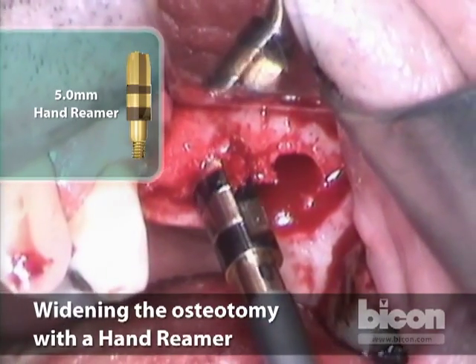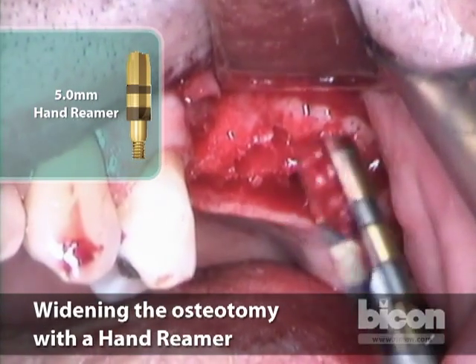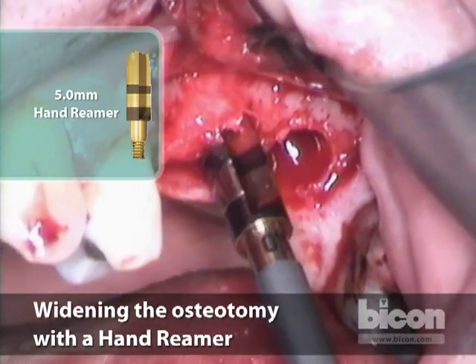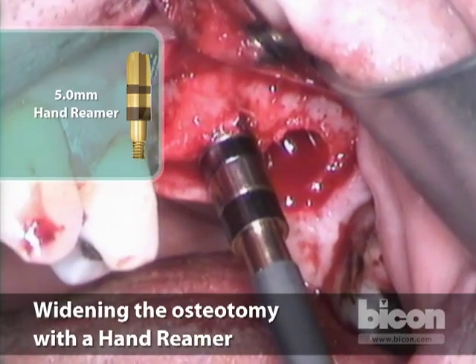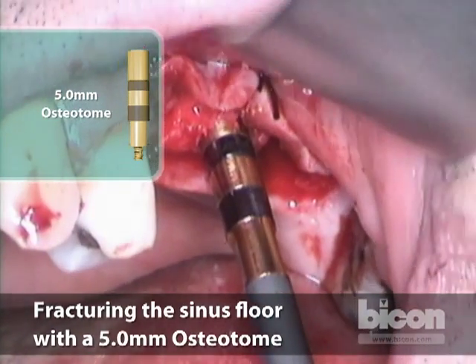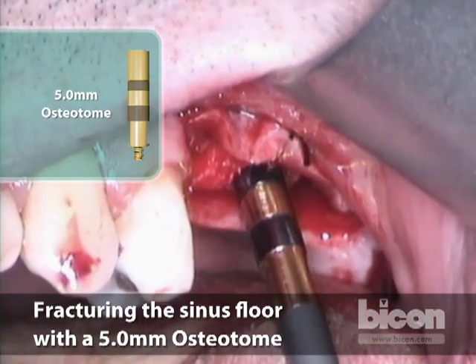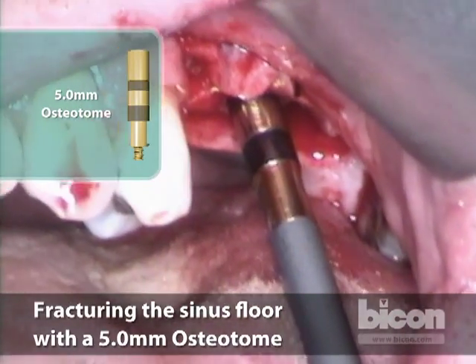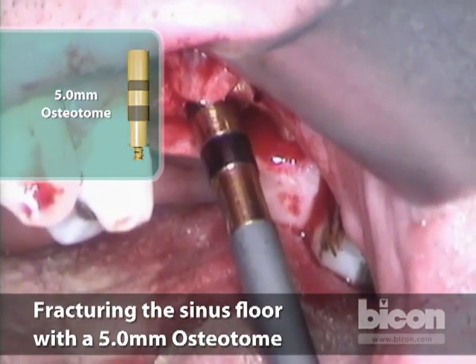As you can see, this is the same size we had — the osteotomy is still five millimeters wide, yet we're getting some bone, all from the floor and the slope leading to the floor. Now it's starting to yield a little bit. With a little bit more tapping — you can hear the noise now. The sound is a lot softer, no longer resonant. That means we just fractured that floor.